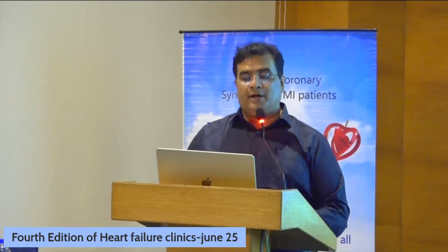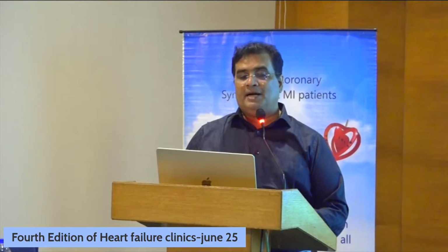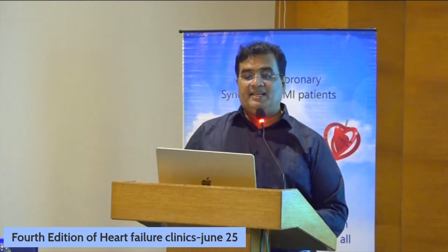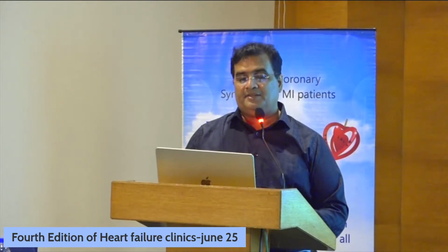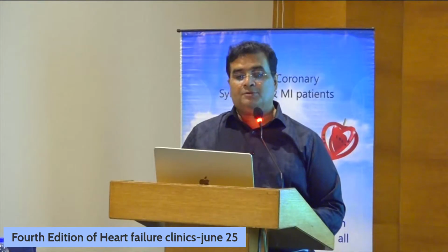We can assess myocardial recovery in multiple ways: thallium, technetium, FDG PET, MRI, dobutamine MRI, dobutamine echo. If you see, the highest sensitivity is with late gadolinium enhancement. If there is a late gadolinium enhancement, it usually indicates the myocardium is gone. Whereas if the dobutamine stress echo or stress CMR, cardiac MRI, is positive, that means there is a recovery with dobutamine stress, and the myocardium has a higher chance of recovery. So you have multiple modalities with different possibilities of recovery.